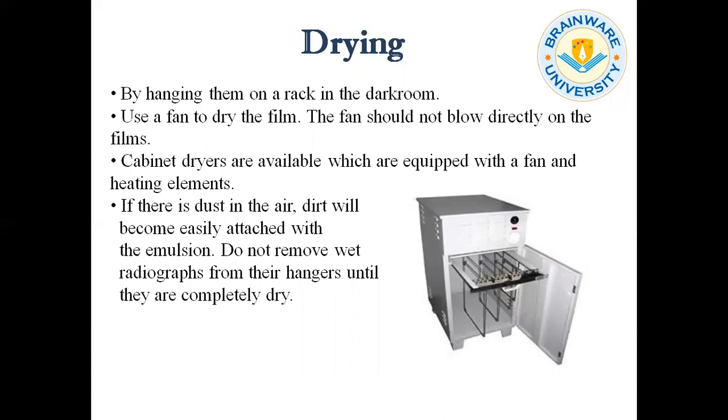And the last stage of film processing is drying the film. After taking it out from the washing tank, it is important to dry the radiograph before handing it over to the patient. By hanging them on a rack in a dark room and a dark dust-free area, and by the use of a fan, we can dry a radiograph. But the fan should not blow directly on the film.